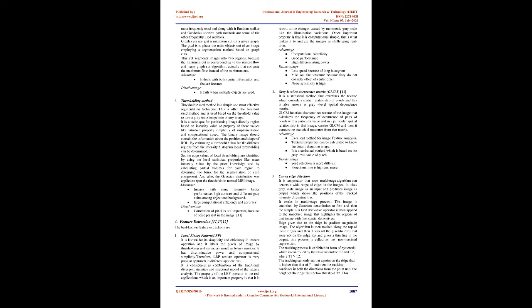Region growing is also free from noise and all the pixels are interconnected without any discontinuity. Advantage. It removes over and under segmentation. Disadvantage. Selection of seed is difficult. Execution time is high.